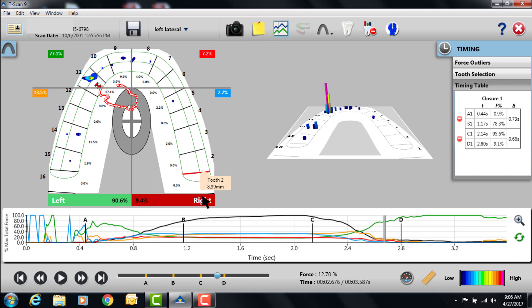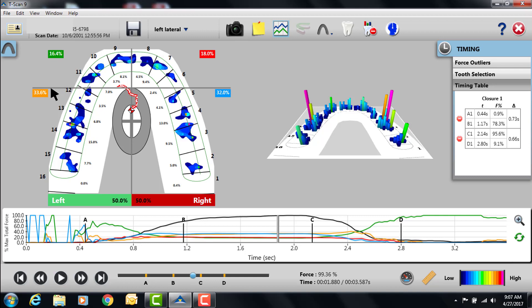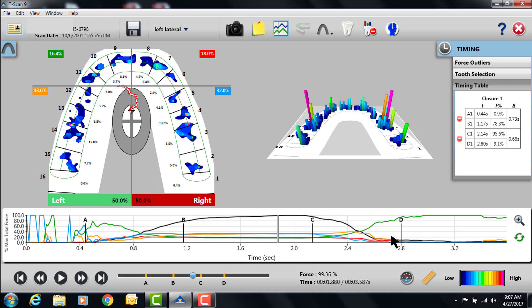We want to click at the maximum intercuspidative area, and you want to identify the side you're sliding to, in this case left, and we want to make sure that the horizontal bar here, specific to the left, is behind tooth number 11, which would be the canine. Sometimes you just click on it and you can adjust it, and this will adjust the lines in the graph, because the yellow is representative of your left posterior, blue is your right posterior.